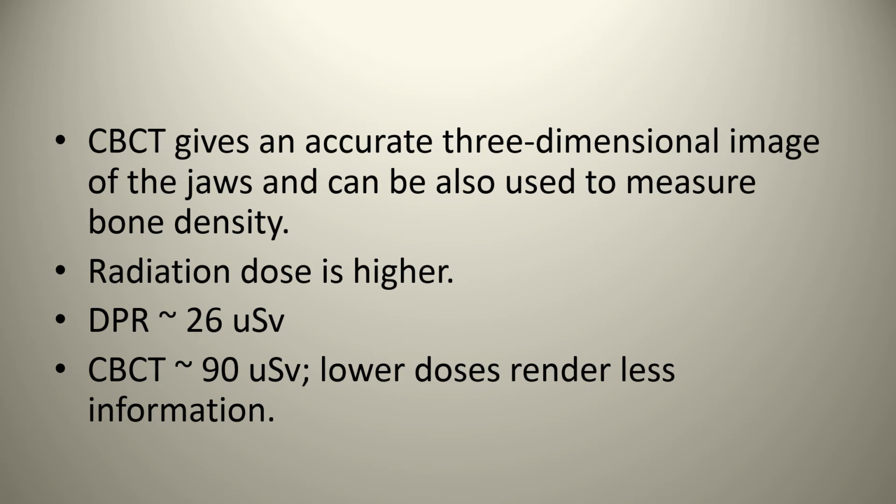However, as many of you who've been out there working in the world of digital imaging will realize, some panorexes or some digital radiographic equipment, things you can buy in various places, don't necessarily look as clear as the nice panorexes that you see advertised at various conventions. So unfortunately, in order to get more information, you have to give the patient a higher radiation dosage.